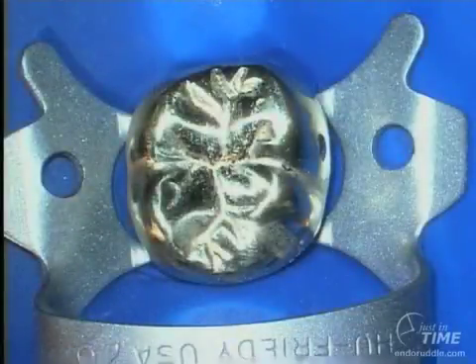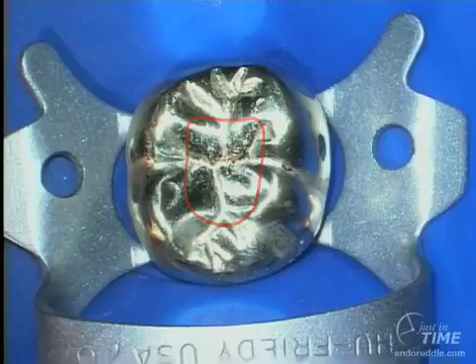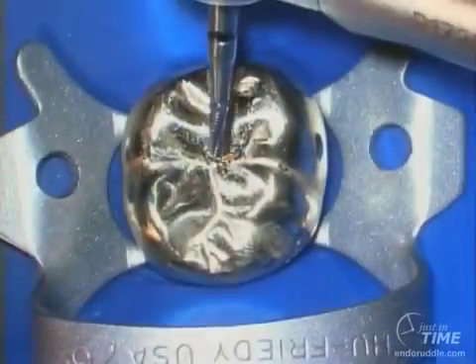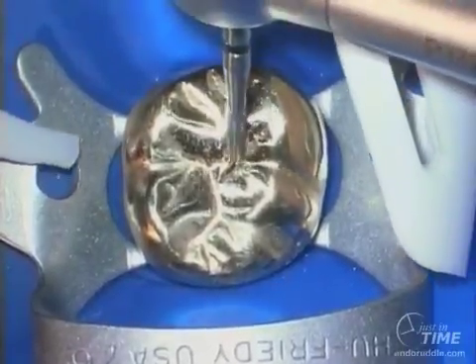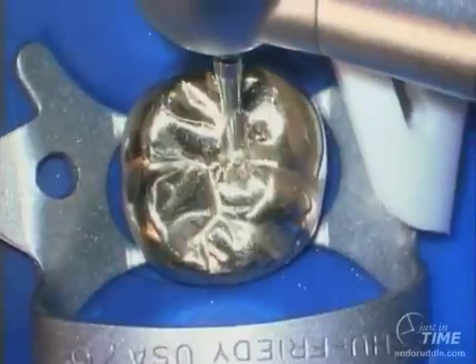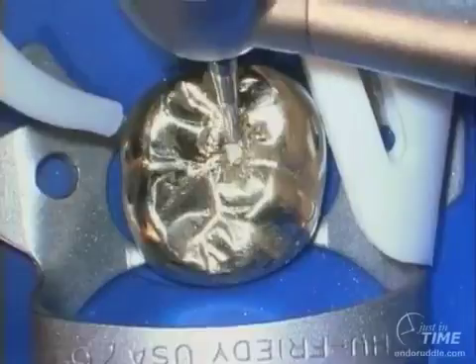Once we have sufficiently isolated the tooth to be treated endodontically, we're ready to begin to envision our access outline pattern. There's an old expression: start with the end in mind. I like to use the transmetal burr — it will reduce a lot of unwanted vibration. Lay the head of the handpiece over on its side to make the burr more of a side-cutting burr rather than an end-cutting burr. It's important to create a little window almost immediately so we can use the side of the burr to begin to remove gold and to get access into the underlying dentin.